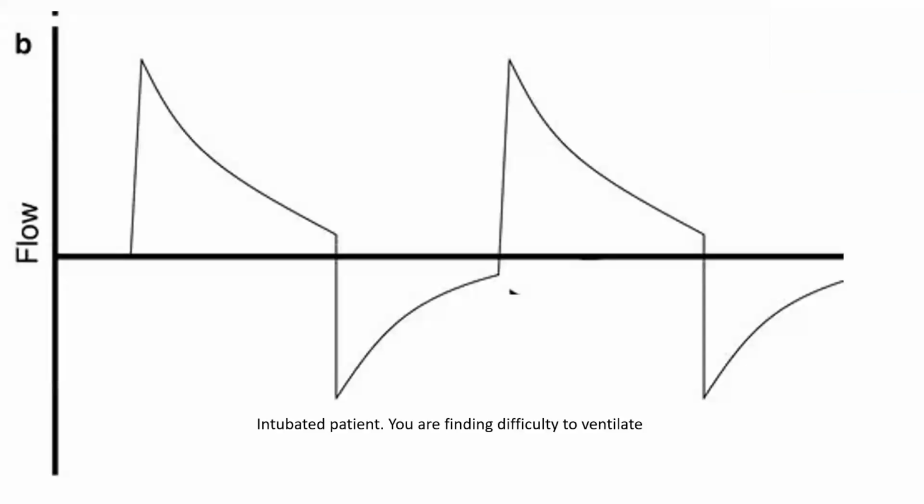Yes, the patient will find it difficult to breathe. So the work of breathing will increase. Correct. So as the breath stacking keeps on increasing, then definitely there is an increased difficulty in trigger, an increased work of breathing, and thus the patient has to take more effort to trigger the ventilator.